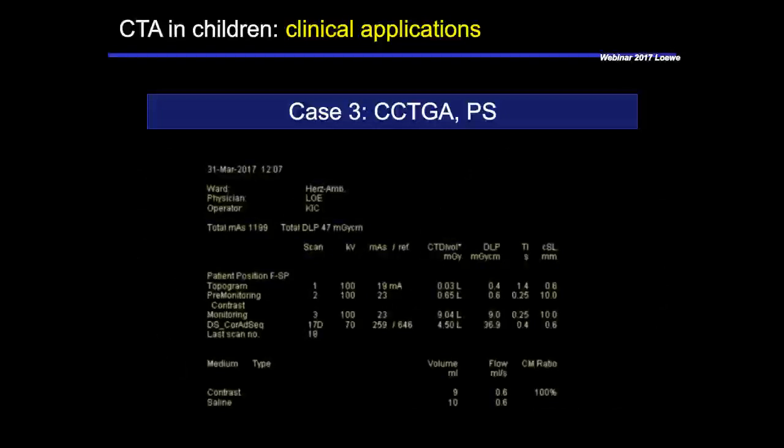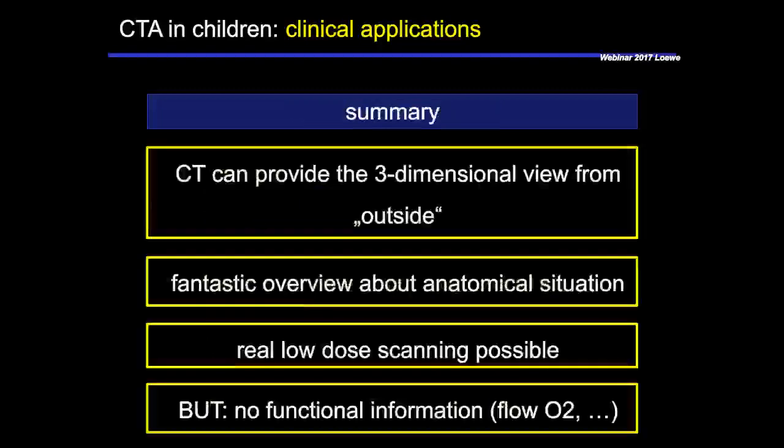So let me come to my conclusion. CT can provide the three-dimensional view from outside, and that's a totally new thing, and it's highly requested by the cardiac surgeons. It provides a fantastic overview of the anatomical situation. Real low-dose scanning becomes possible.